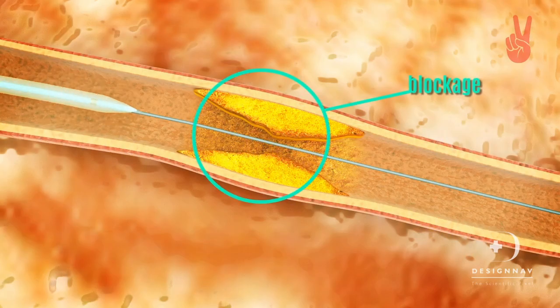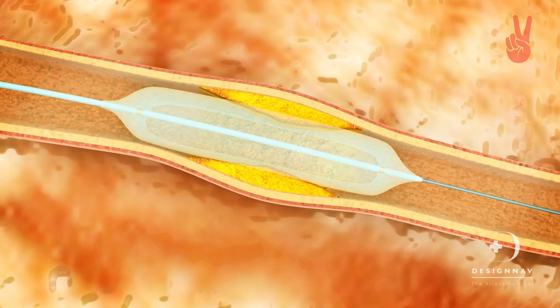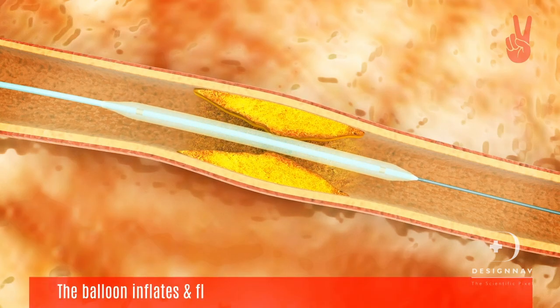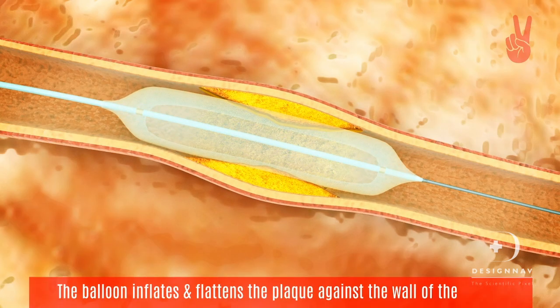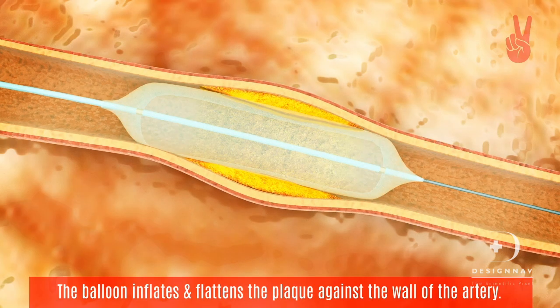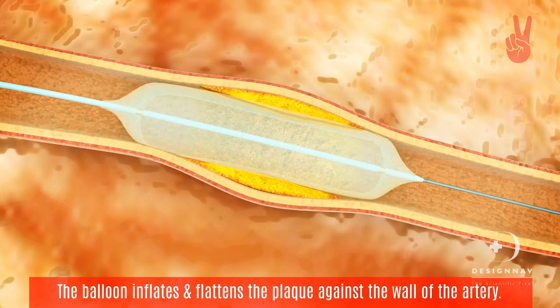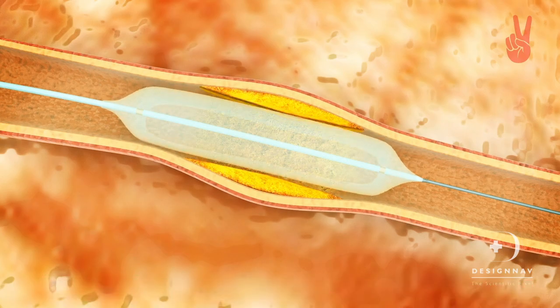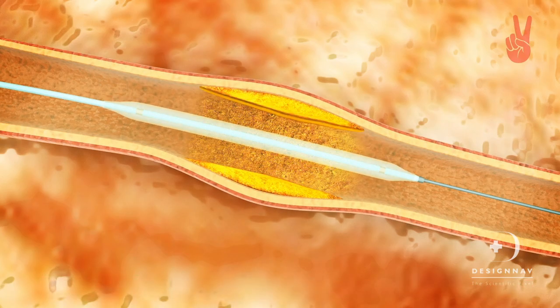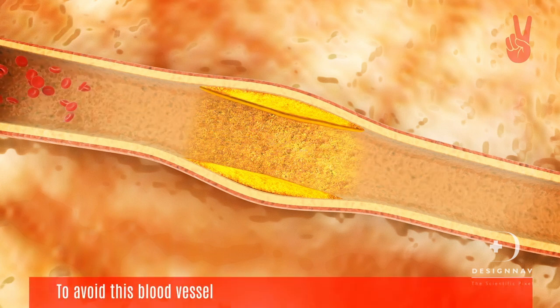Once in position, the balloon is inflated several times. As the balloon inflates, it flattens the plaque against the wall of the artery. As the balloon inflates, plaque that extends into the wall of the artery may tear or crack. This is normal and necessary. After the blocked or narrowed vessel is reopened, the balloon catheter is withdrawn from the blood vessel.